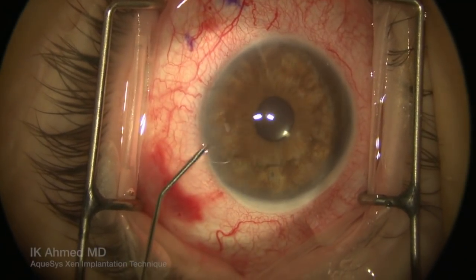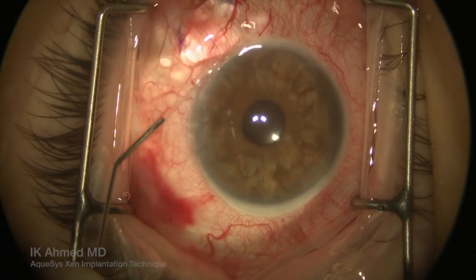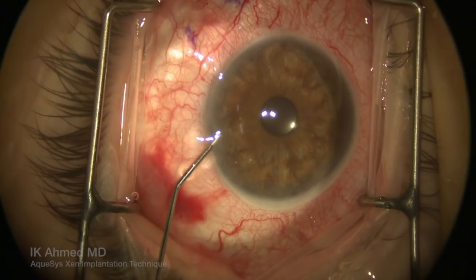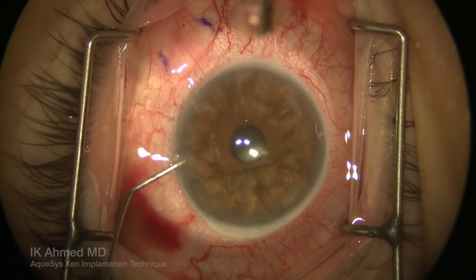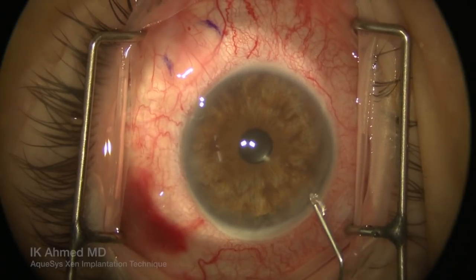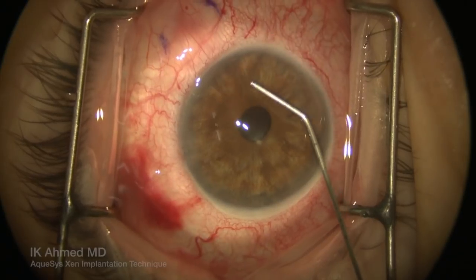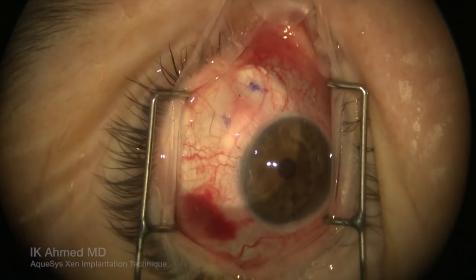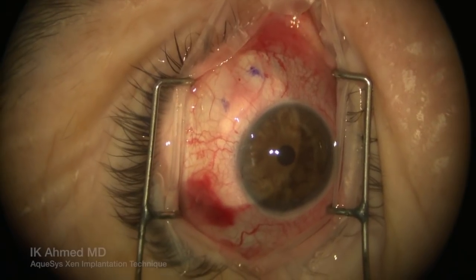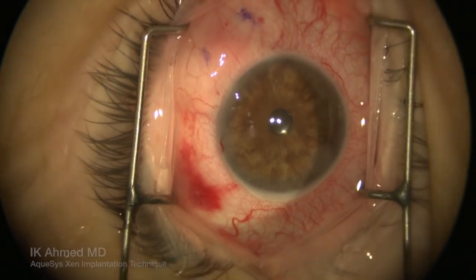We'll then evacuate the viscoelastic that had been placed in the anterior chamber with some BSS, and we will then see a bleb that will be raised shortly in the quadrant of interest. Although there is a direct communication from the anterior chamber to the subconjunctival space, the built-in resistance within the Zen micro fistula prevents excessive flow and hypotony. The bleb, which is visualized here supranasally, develops into a low-lying area of elevation in the postoperative period.